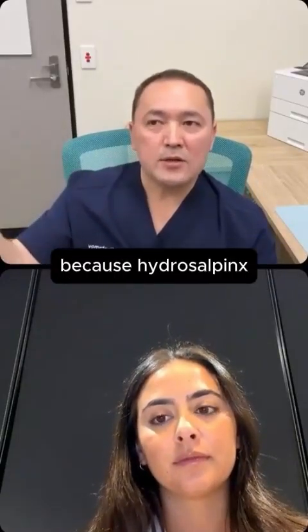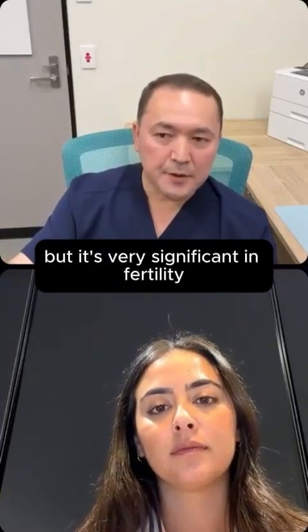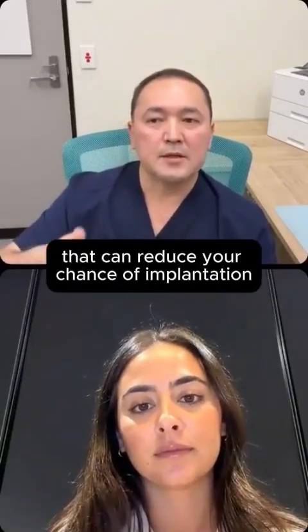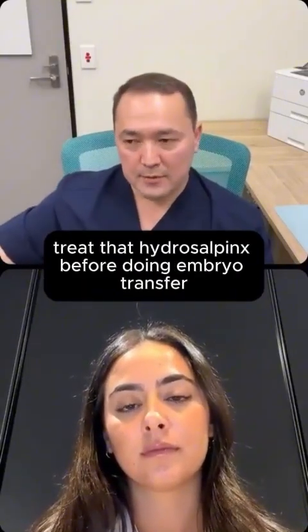Also, a basic fertility scan should exclude hydrosalpinx. Why? Because hydrosalpinx may not be that significant in gynecology, but it's very significant in fertility investigation or treatment. Because if you have hydrosalpinx, that can reduce the chance of implantation. We need to treat that hydrosalpinx before doing embryo transfer.